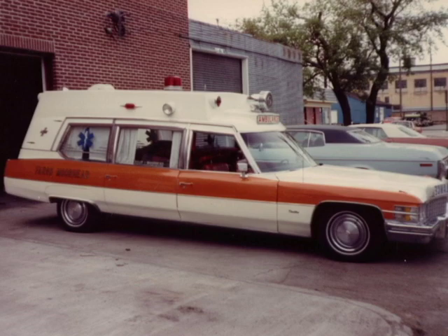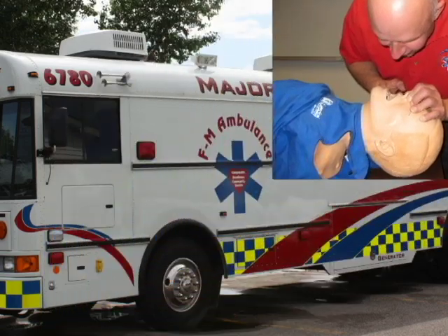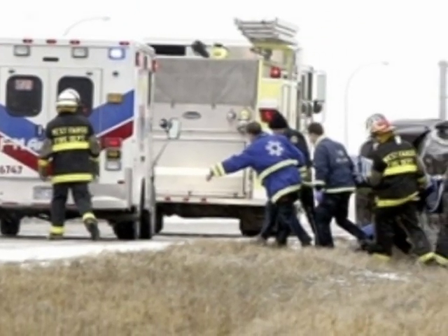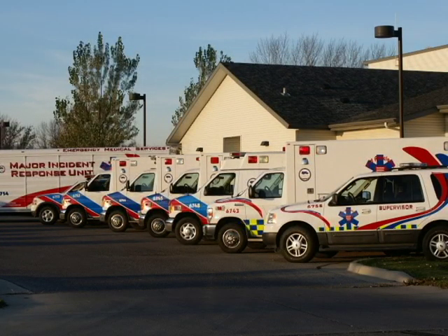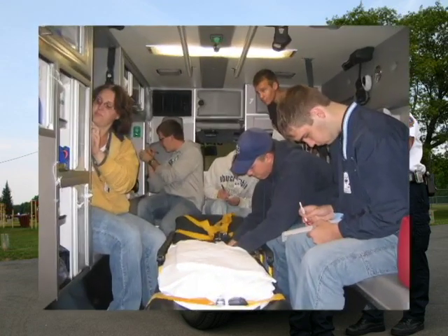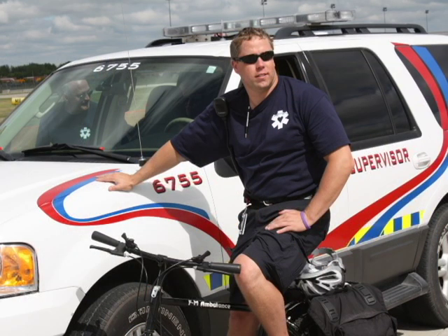In this short presentation, we'll discuss some of the most common errors people make when using automated external defibrillators. We'll discuss when the AED should be used, why an AED might not deliver shock, why it is important to avoid vibration or movement of the patient when an AED is analyzing a heart rhythm. We'll also look at environmental concerns, such as extreme heat or cold. Additionally, we'll discuss electrode patch placement on the patient's torso, as well as the importance of checking the AED for expired patches or batteries.